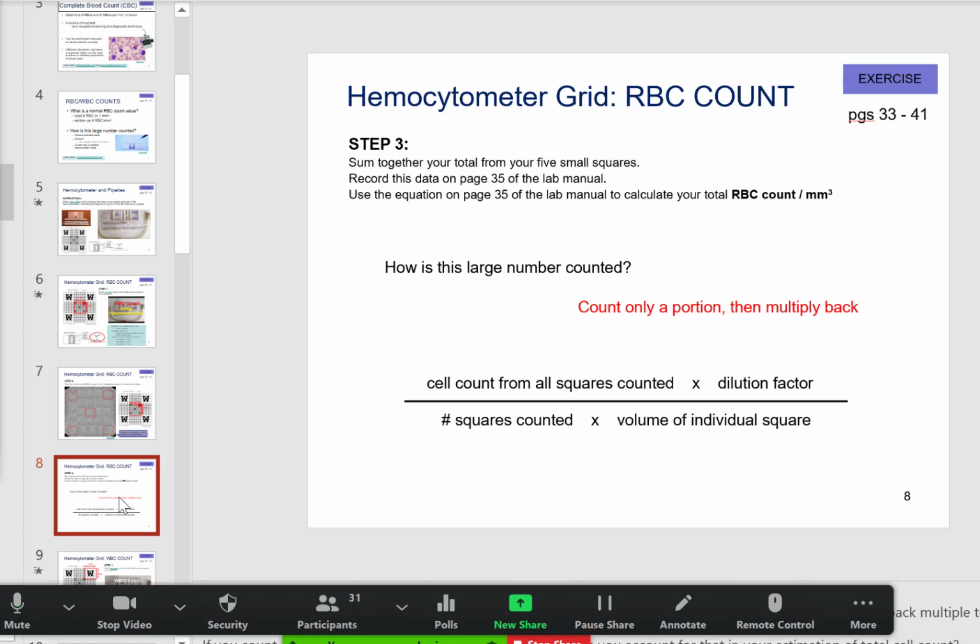Did you add up all 5 of your squares? What was the total cell count for you all, just counting the 5 squares? I got 446. Okay. I got 436. Yeah, 436. The Monday, Wednesday class was very comparable to what you all are saying. Some people were in the 430s, and some people were up in the low 500s. That's pretty reasonable. When I counted, I got 479. So we're within range of each other. That's good. That tells me that you did it right.